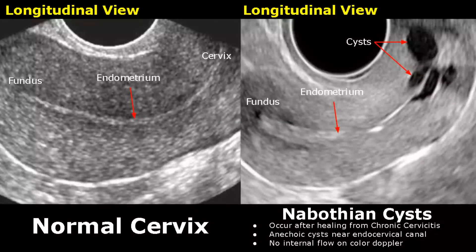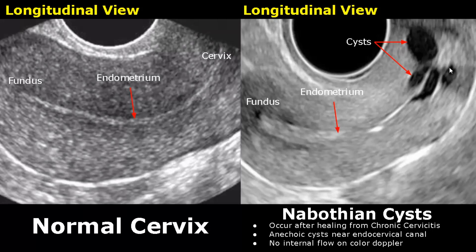Nabothian cysts are benign cysts and usually occur after the cervix heals from chronic cervicitis. We will see anechoic cysts near the endocervical canal. Some cysts may have internal echoes. On color Doppler, we will not see any internal flow.